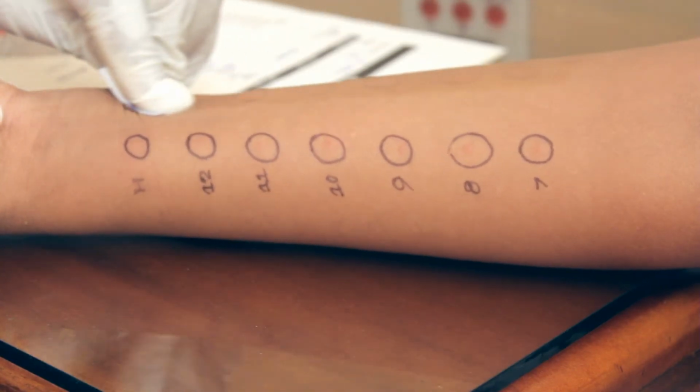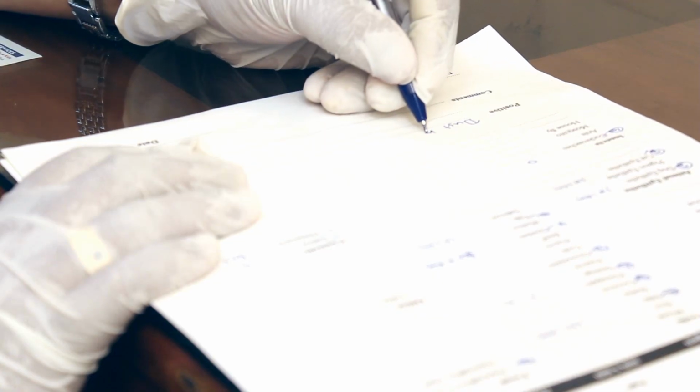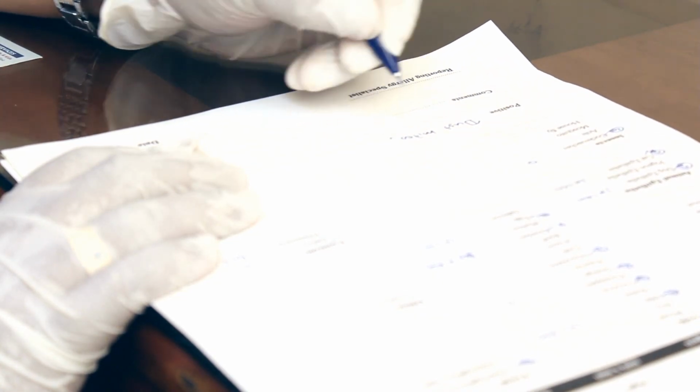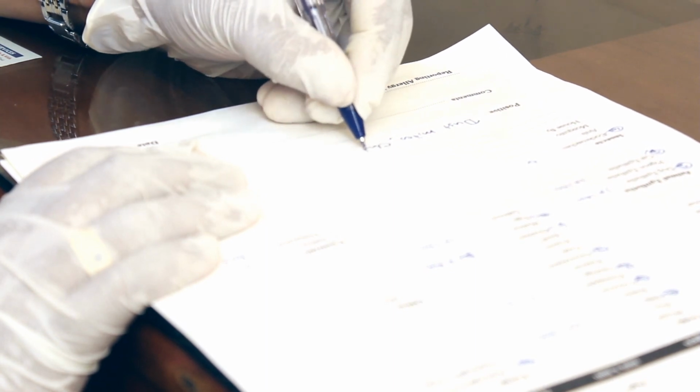Then to clean the hand, and the positive reactions are entered. After concluding the test, the next step is explaining the results to the patient and giving advice as to what to do according to the positive allergens that the patient has shown during the testing.